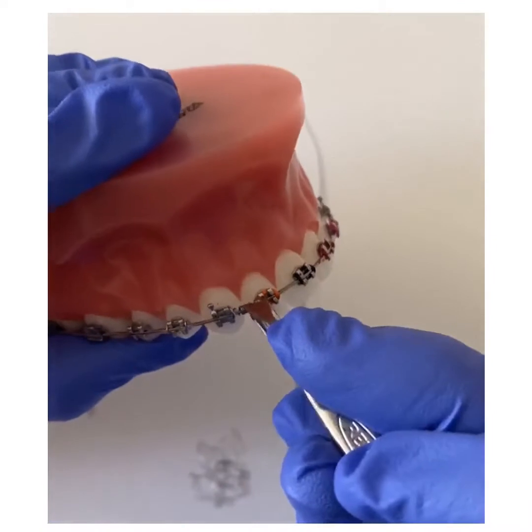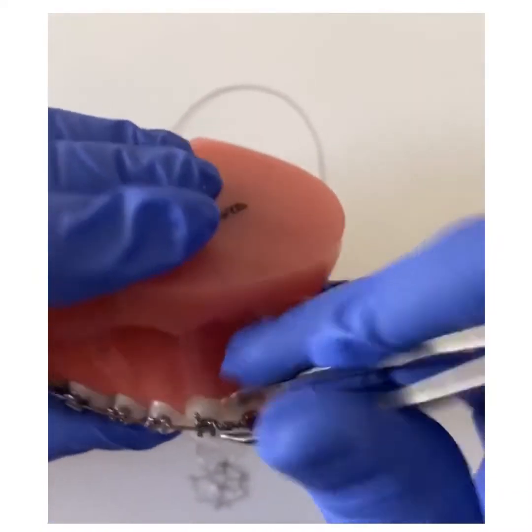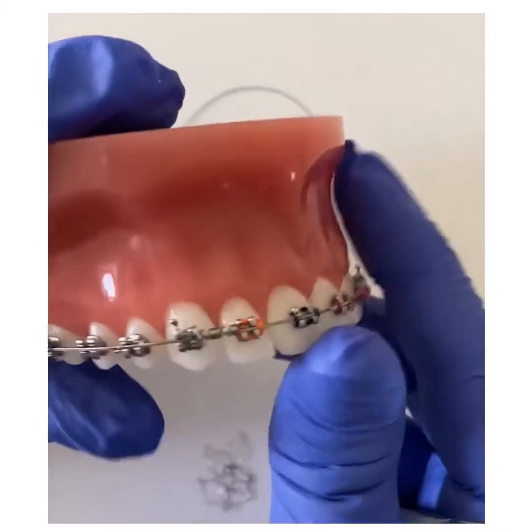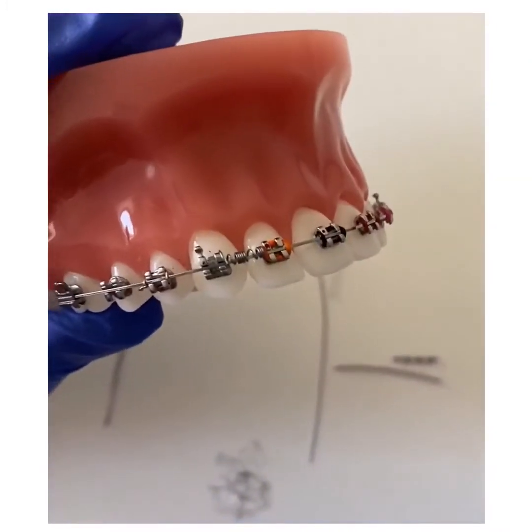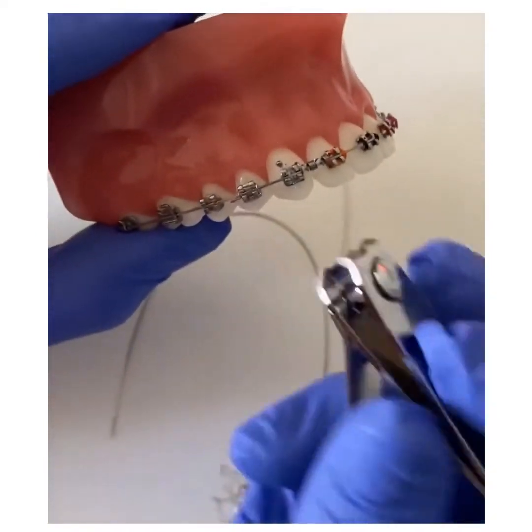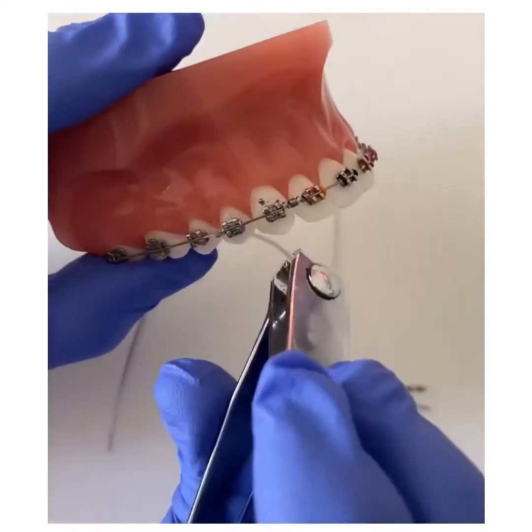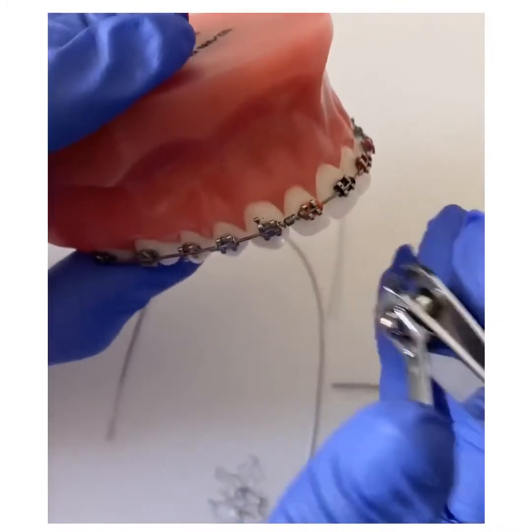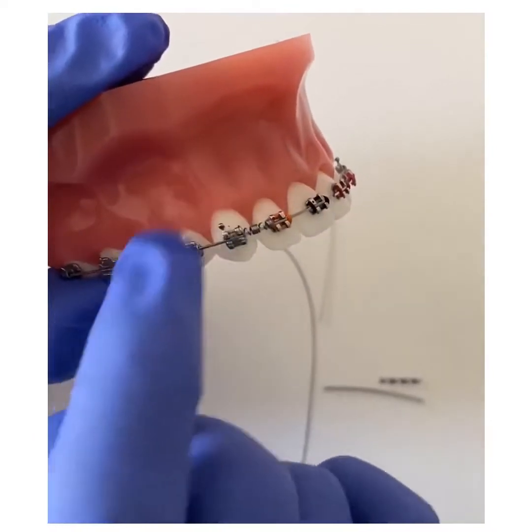Just take your tweezers and keep rotating the coil until you get that little tail inside. You can also take a clean pair of nail clippers and snip the end of the coil to smooth it over.